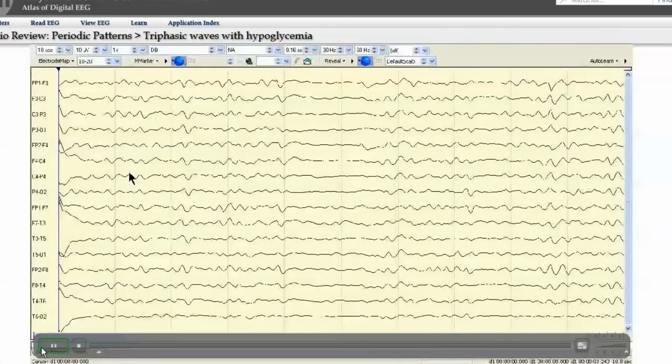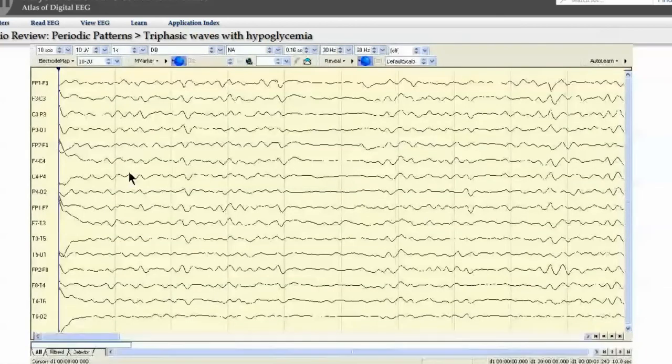This EEG was obtained in an intensive care unit. It is remarkable for the absence of movement and muscle artifacts. This patient experienced severe hypoglycemia and is in coma. The most marked features here are the diffuse slowing of background activity. Even when the patient is stimulated, activity rarely exceeds about 6 cycles per second.